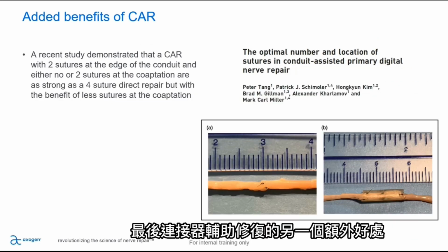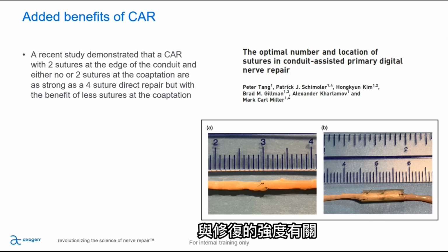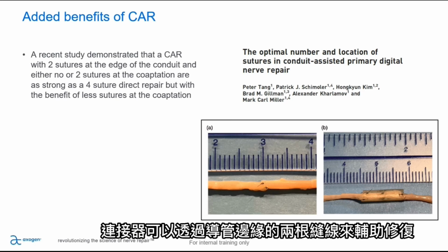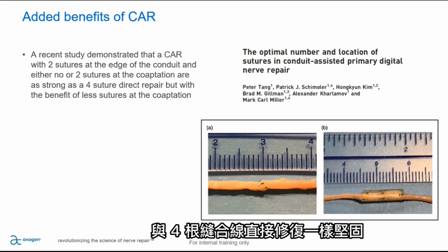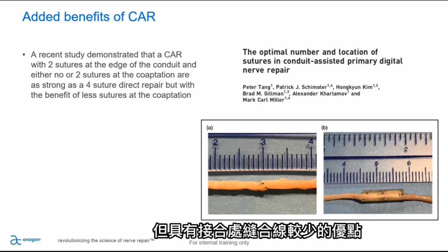And then finally, another little added benefit of connector-assisted repair has to do with the strength of the repair. This was a study that looked at how strong coaptations were with varying numbers of sutures, either just for direct repair or with a connector-assisted repair. And what they found was that a connector-assisted repair with 2 sutures at the edge of the conduit and either no or 2 sutures at the coaptation was just as strong as a 4-suture direct repair, but had the benefit of fewer sutures at the coaptation.